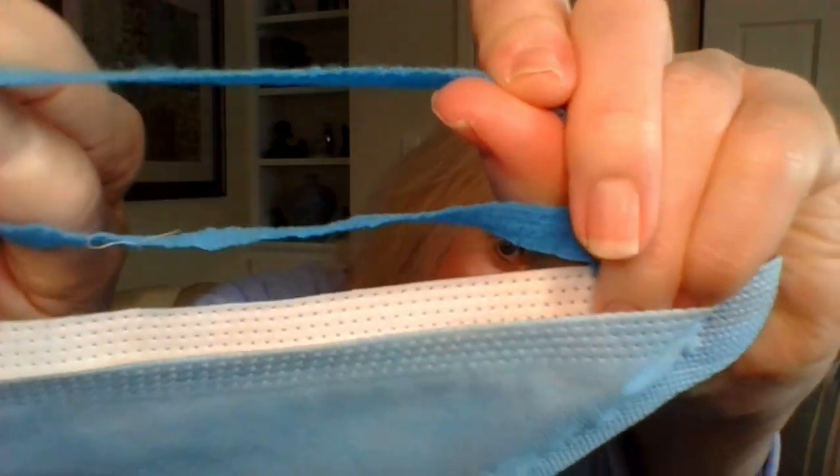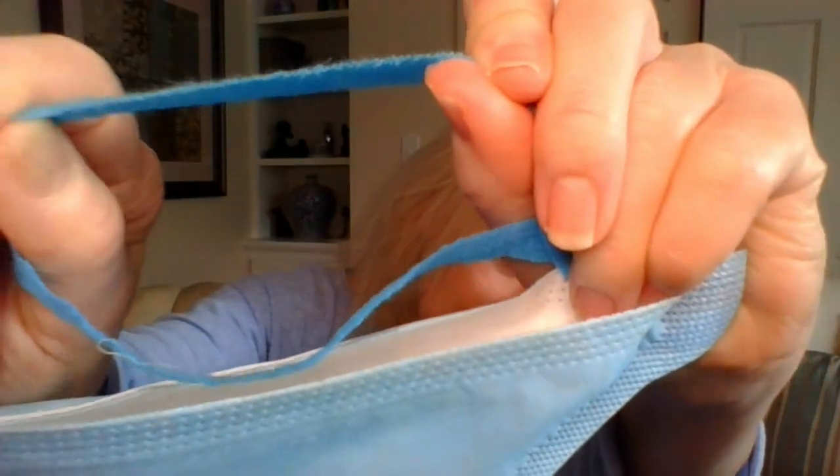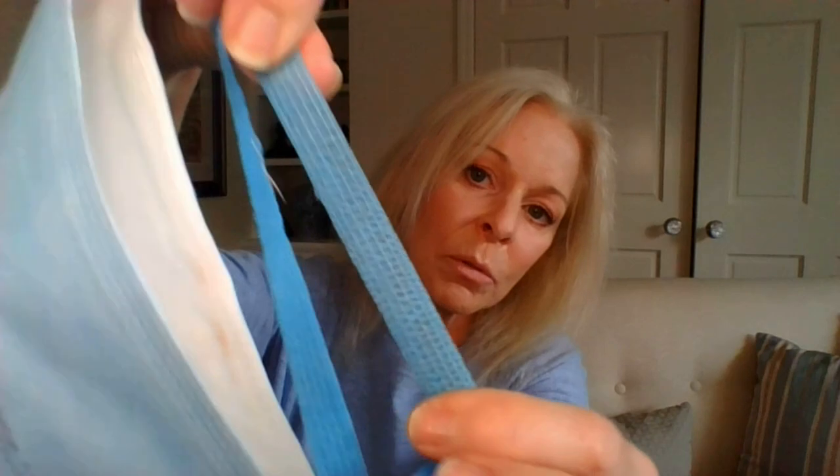I want to give a close-up of the straps so you can see. Like I said, it's kind of like a crepe paper but very elastic — really very soft and really very thin. They sort of feel like that material that surgical gowns are made of with just tiny threads of elastic going through it. I really do like these straps. I find that they're very comfortable, and the fact that they're wide I think contributes to a lot of comfort as well.